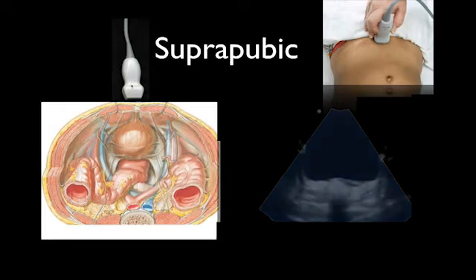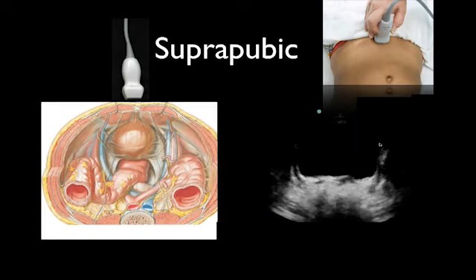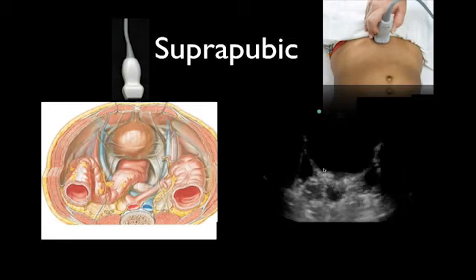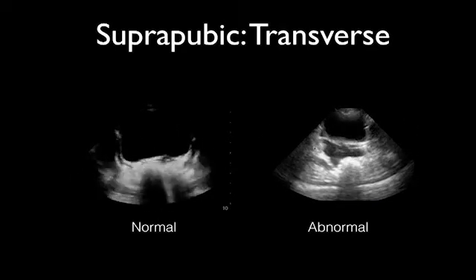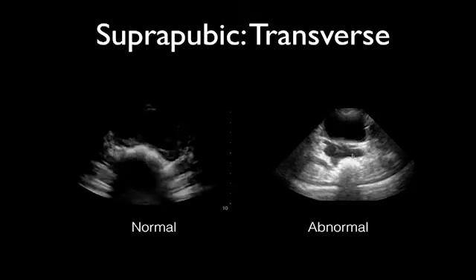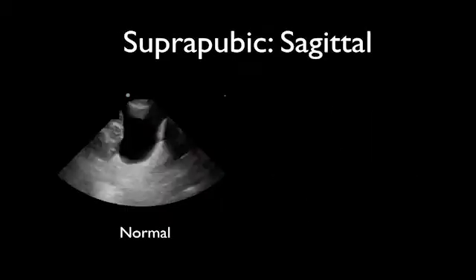You have the phased array probe that you use for the rest of your HiMAP. You see your bladder as a rectangle, and you don't see any anechoic fluid deep or posterior to it. So side by side, here's the normal pelvis with the bladder, and abnormal is this anechoic fluid posterior. Make sure that you decrease that far gain in your TGC so that you can actually see this fluid.